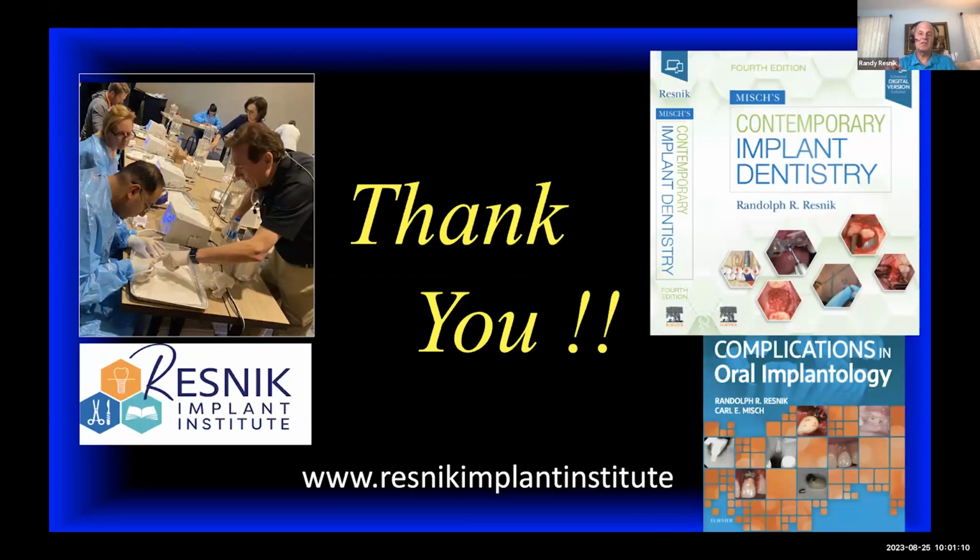Secondly, what has changed, Neil, back when you and I started this in oral implantology, what did we want? We wanted the longest implant, right? 18 millimeter Brånemark implants. That's what everyone used. Now the design is so much better. We don't need longer implants. So shorter implants work very well. Not ultra short, but short implants, usually 7 or 8 millimeter implants work very well back there because the diameter is larger. Right, right. Excellent.